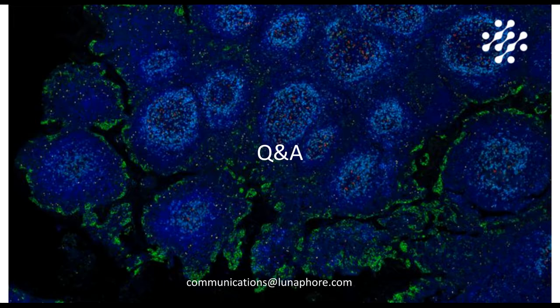Thank you so much, Alexandre. Are the primary antibodies used commercially available? Yes, so LabSat is an open platform, and it's basically compatible with every commercially available reagent or kit. So for this study in particular, we have used off-the-shelf primary antibodies. And for multiplexing TSA assays, we have used commercially available monoclonal antibodies.